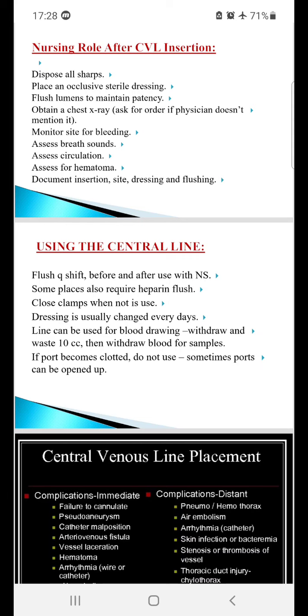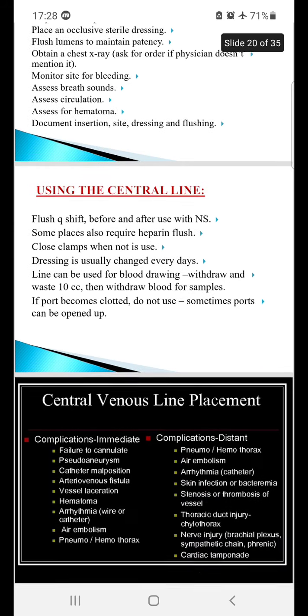Sometimes we use heparin. Close ports with clamps if not in use. It can be used for blood drawing by withdrawing 10 cc first and then taking the sample for testing.